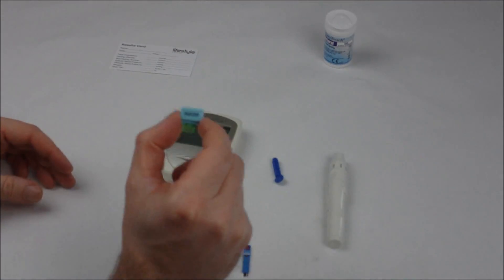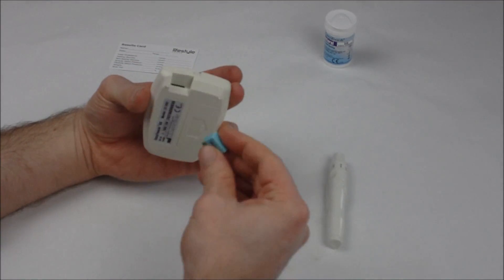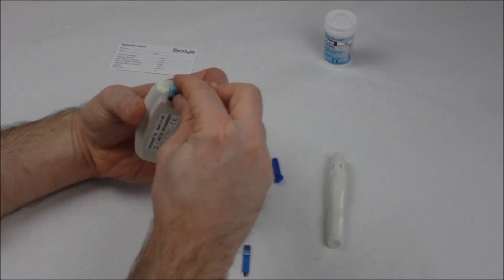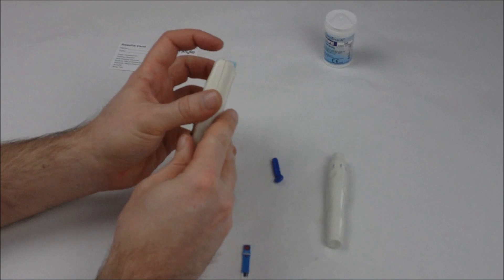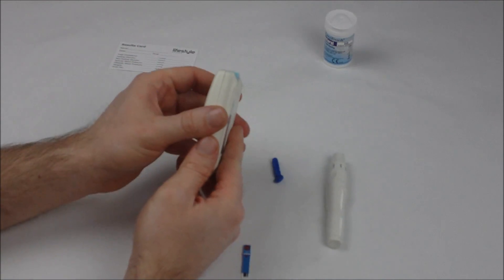First of all, insert your code key into the back of your monitor. This should fit in just one orientation. Push down and notice how the code key runs flat with the top of the monitor.